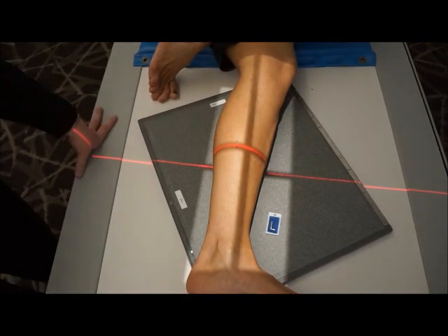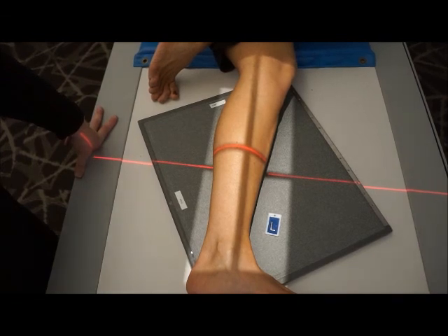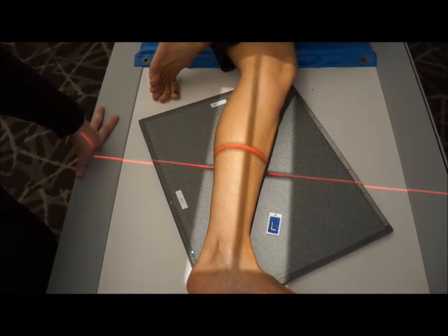If you clip the malleoli or the knee joint, you are going to be repeating this particular position. So this is a two-view lower extremity or tib-fib.